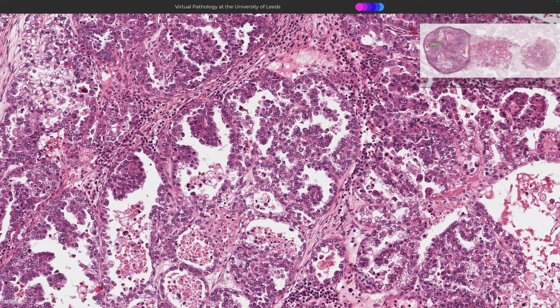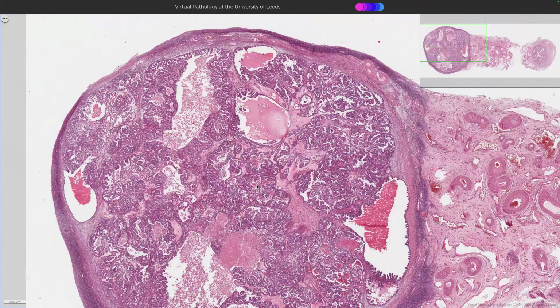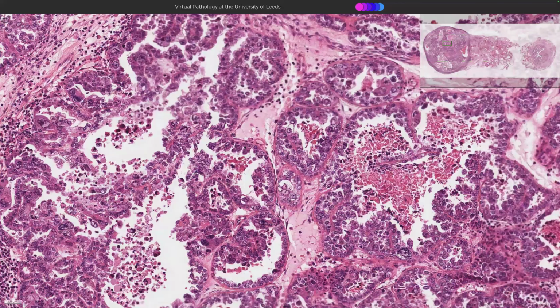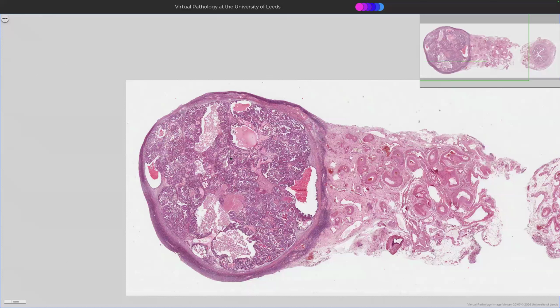So usually in clear cell, you have more acinar than you have papillary. And even though it's papillary, they're kind of arranged in little acinar groups. But sometimes in clear cell, the cells aren't clear, but they're pretty much always square and hobnailed. So they have a look to them. But very fortunately, they also have an immunohistochemical profile to them.